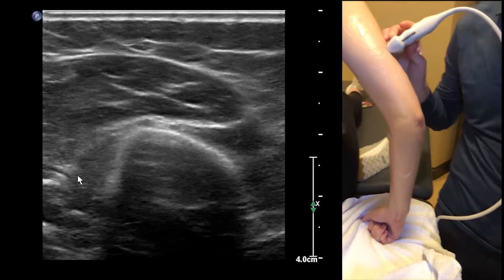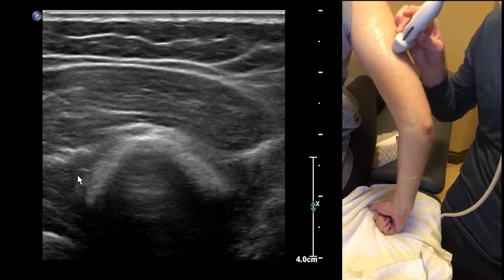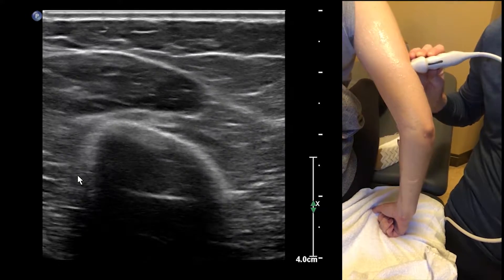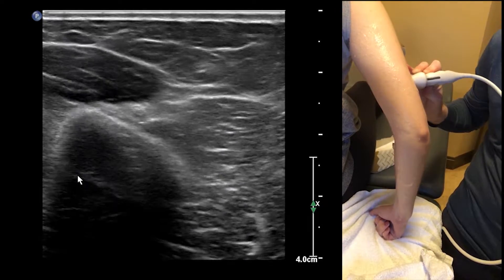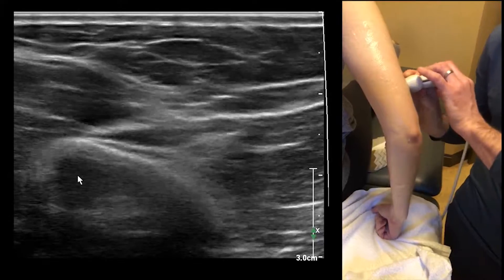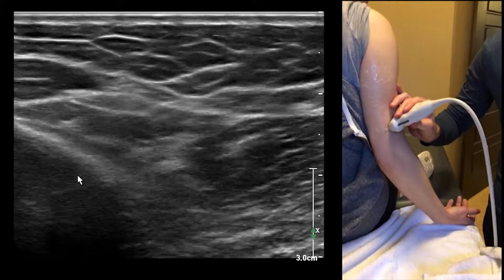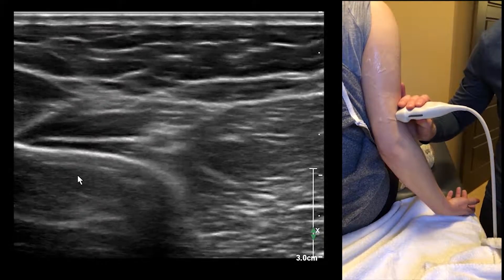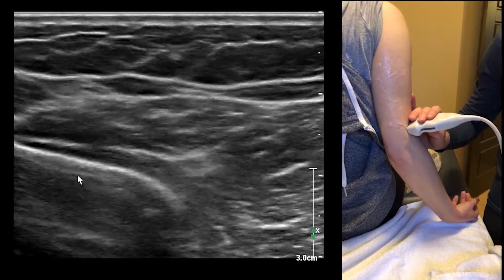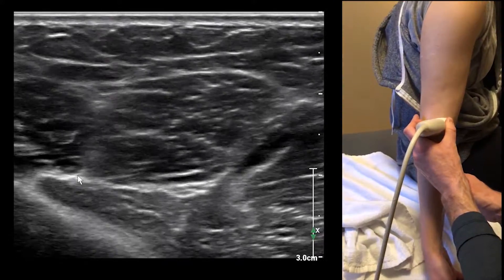Once we pass the spiral groove here, you can see that both the artery and the nerve come right over the humerus — and that's where it's going to get injured. Now the radial nerve is diving deep underneath brachioradialis.